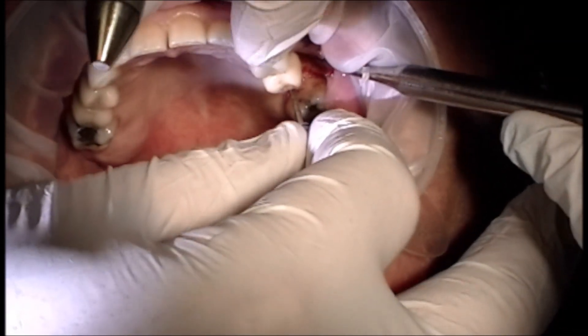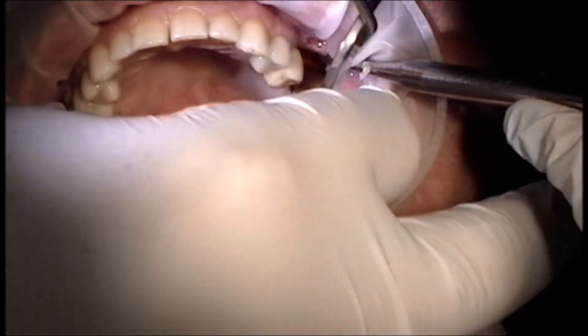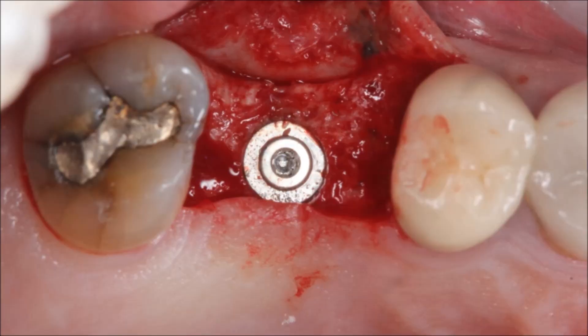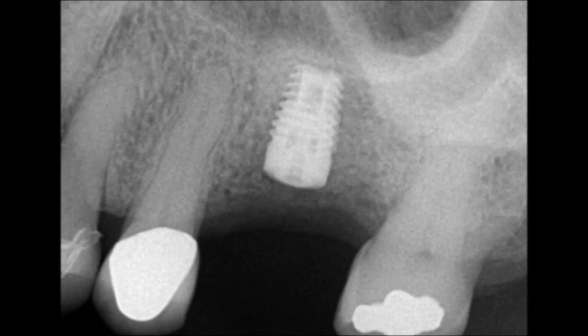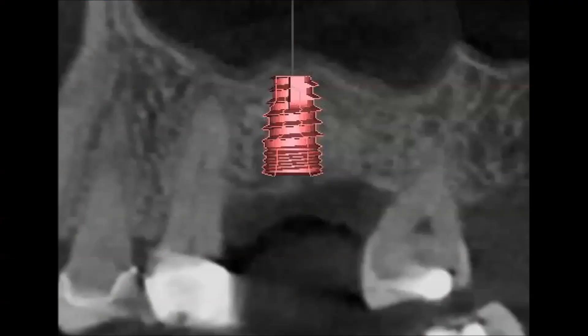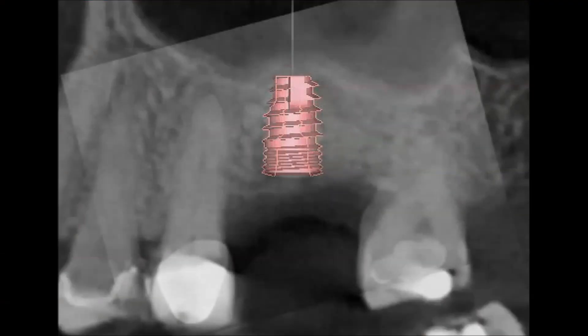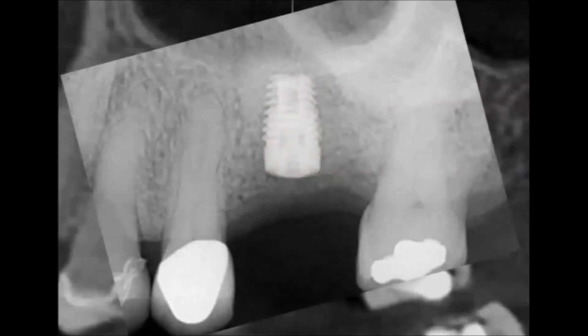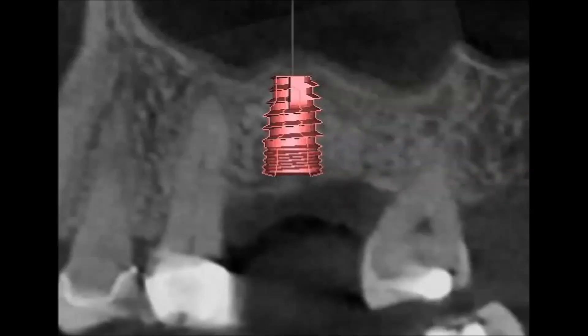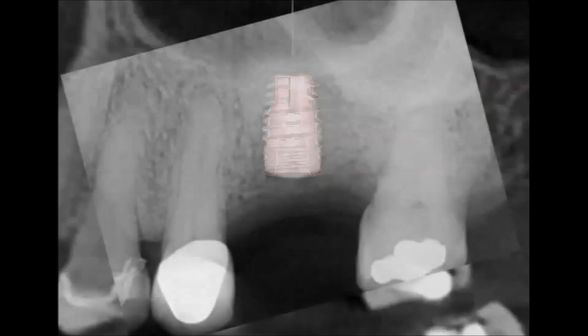Placing the cover screw on this — I like to get primary closure with my implants. It just allows for more predictable healing; I don't have to worry about the patient loading it during the integration period, and it's just led to more predictable results. Here's our implant in place, and here it is on the x-ray. With final closure, these were just three individual Cytoplast PTFE sutures. And the big question is: is it accurate? What I'm doing here is overlaying the planned position with the actual position in Photoshop, and as you can see, it was exactly as planned.